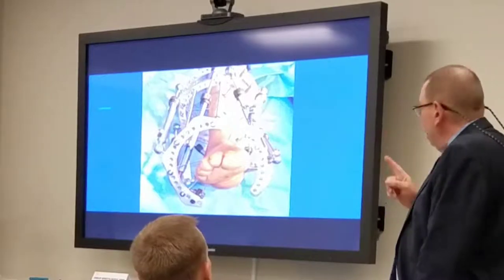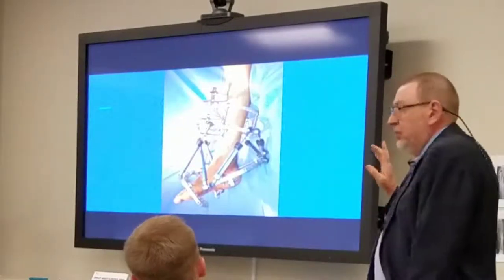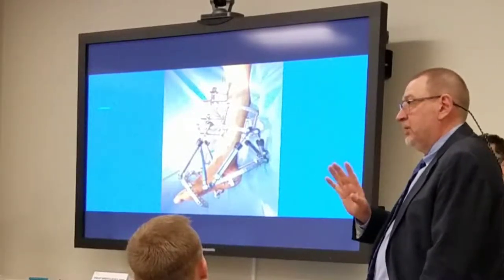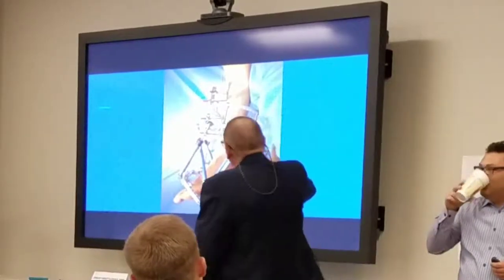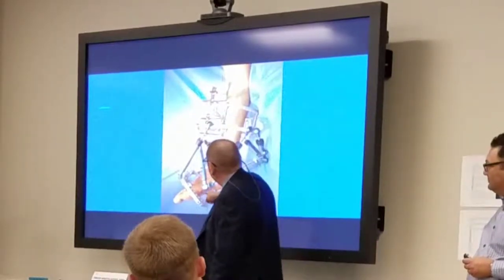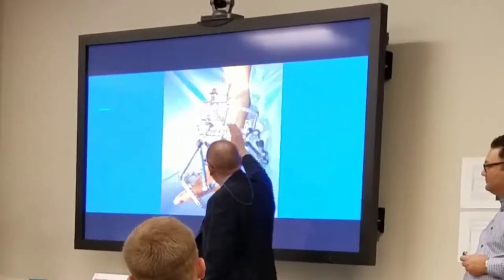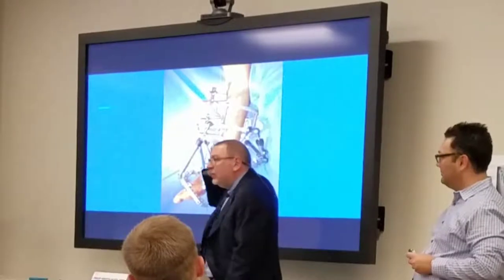Can I suggest something? Can you go back to the first one? Yeah, it's good if your surgeon has experience. If not, you can suggest something a little bit simpler: just use the same butt construct, but put your foot plate this way. So you have the foot plate here, connected to the foot plate here, and then run from here. Then you end up running not to the equinus frame, you're running the butt frame. Correct. Opposite way. So it's another way to do it.